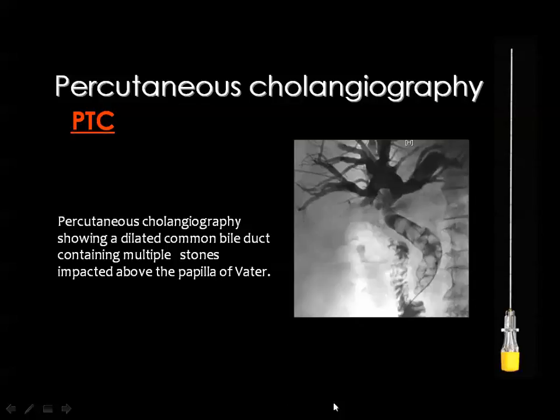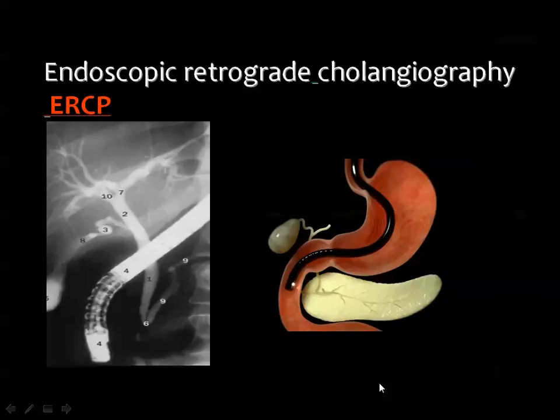Then this is also a percutaneous cholangiogram. Here is the needle, and here you can see that the common bile duct contains too many radiopaque calculi. Of course, you can introduce some guide wires and catheters in order to drain this biliary system to the outside.